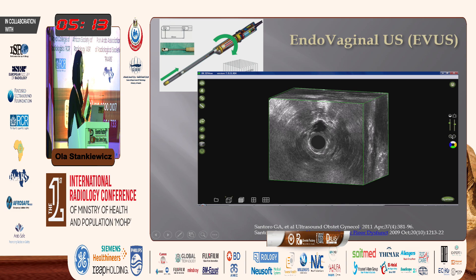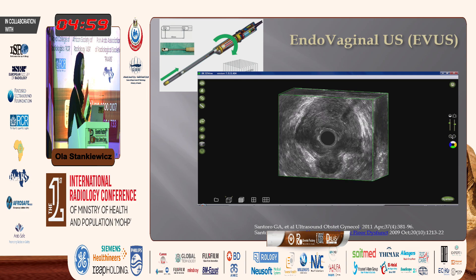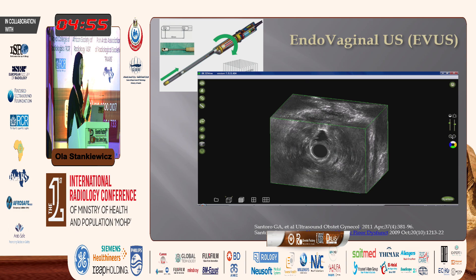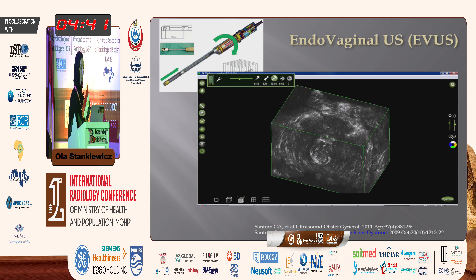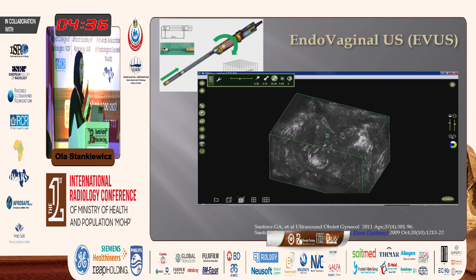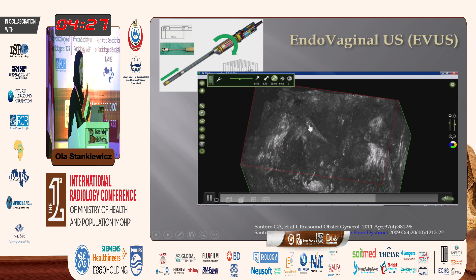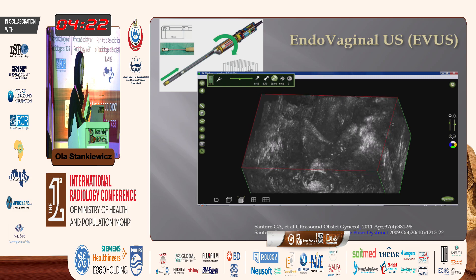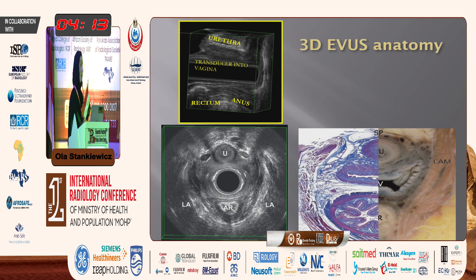The same probe can be inserted into the vagina to see the entire pelvic floor — this is the endovaginal 3D ultrasound. This is how the acquisition is taken, and how we can post-process the images: we can rotate in every angle, adjust brightness and contrast, and view all organs and structures from every single plane. You can even see a tape that has been inserted in the patient. You will be working on these images during the workshop, so please come and have a look.